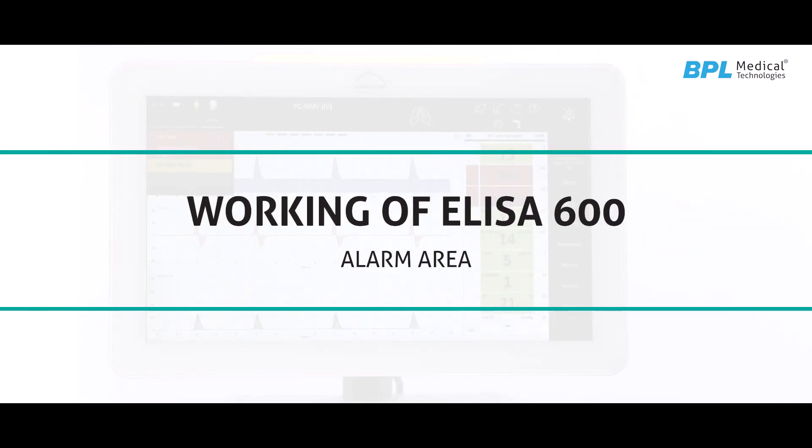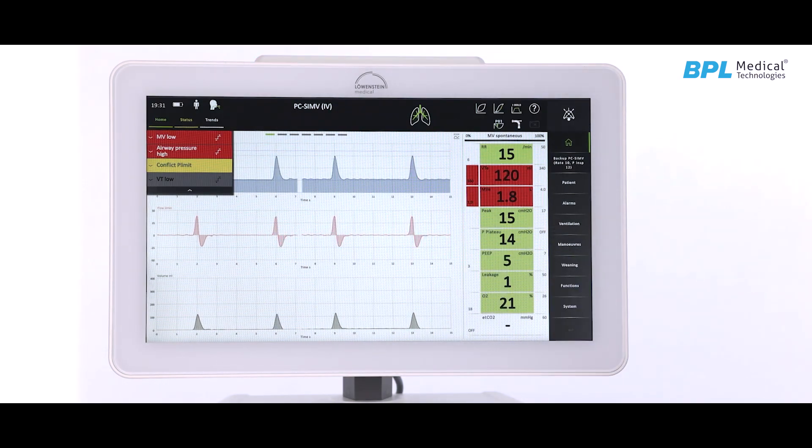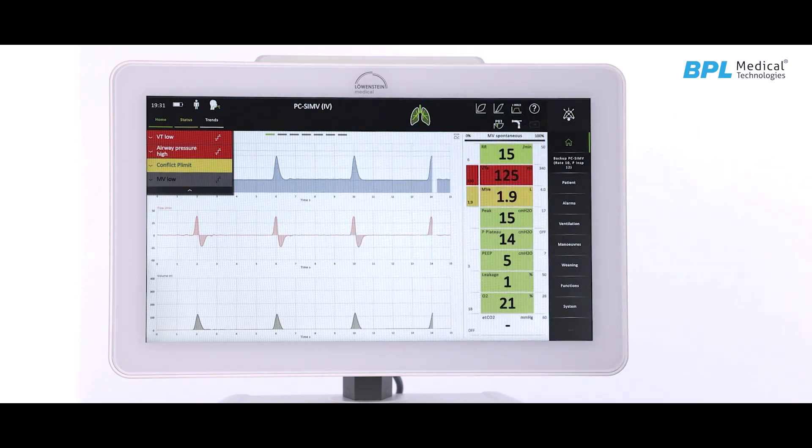ELISA 600 features visual and audible alarms as per IEC standard. Alarms are categorized into two levels: high priority alarms and indicative alarms. High priority alarms are shown in red color with longer tones to immediately capture the user's attention. Indicative alarms are shown in yellow color and have a shorter alarm tone.